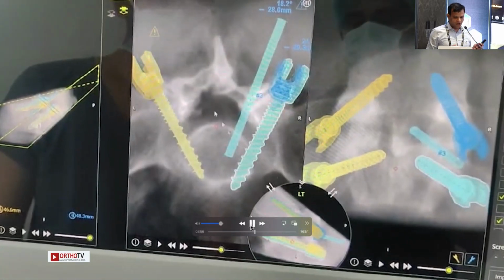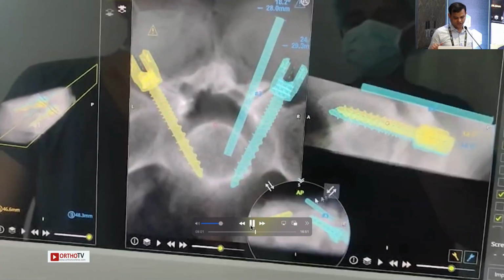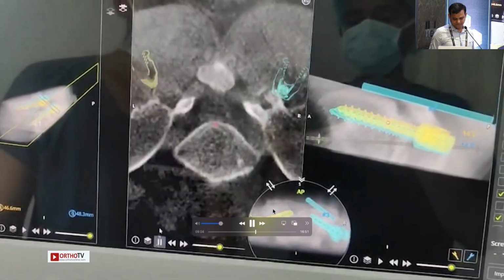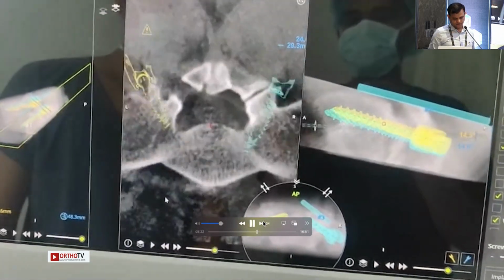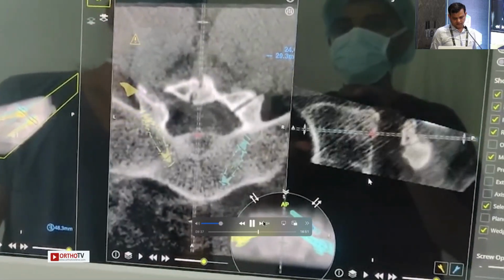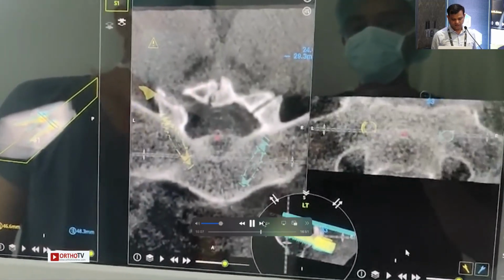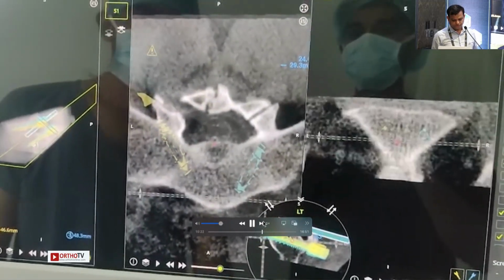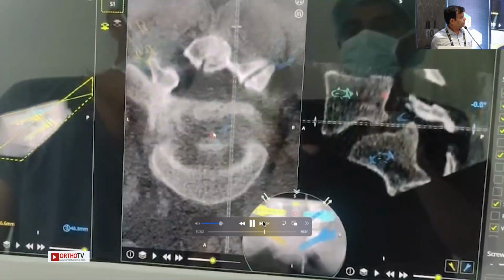I'll show you how much angle. And this one which you see there, that's the planning for the tube. So tube docking also is done through the robot, and after that there is no radiation at all for the surgeon for MI surgeries. So the interbody planning is done through that, and you can see that the screws are planned, and you run through each vertebra. It just takes around 5 minutes to plan around 4 to 8 screws. And that's the tube docking planning, you can see.